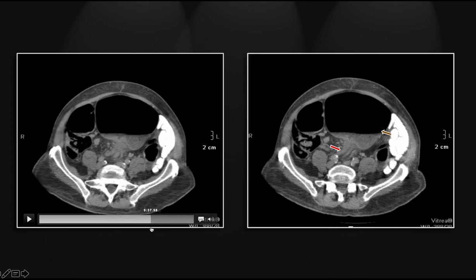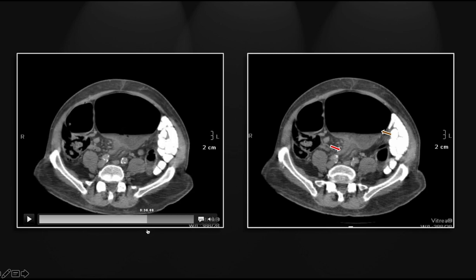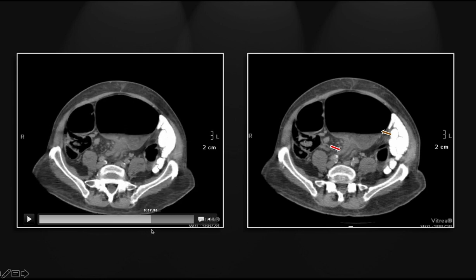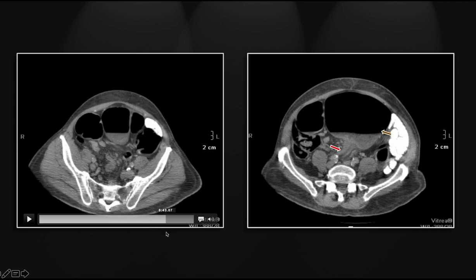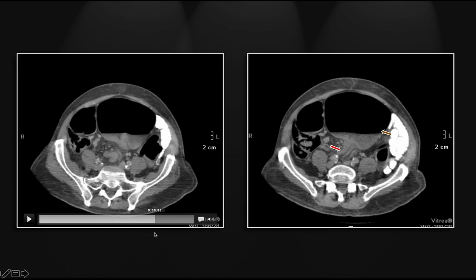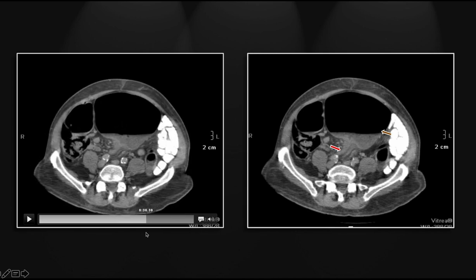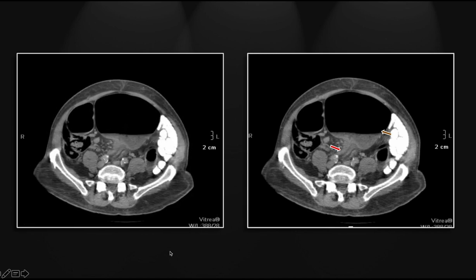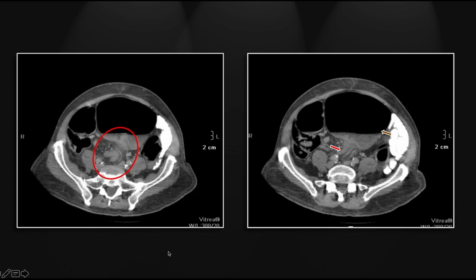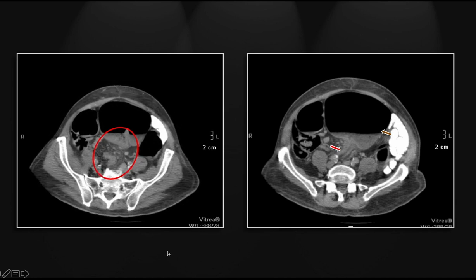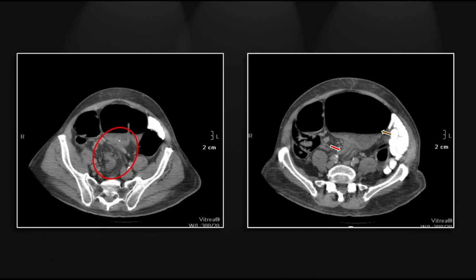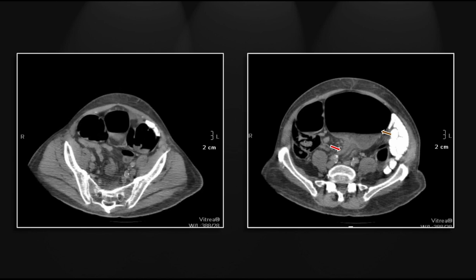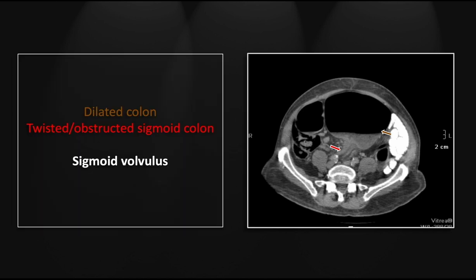As we come inferiorly, there is the twisted and folded portion of the sigmoid, which can really be well appreciated. So that is a sigmoid volvulus.